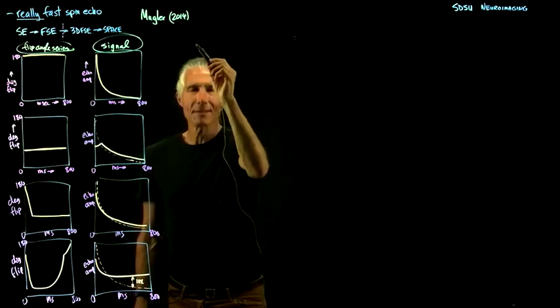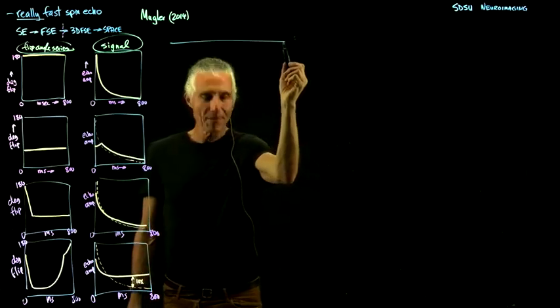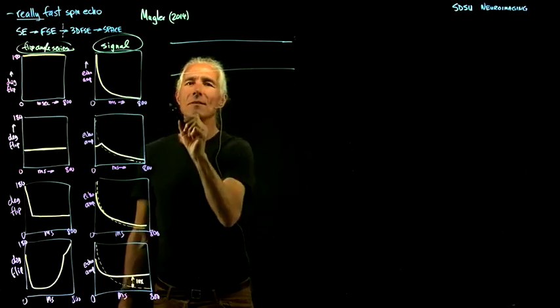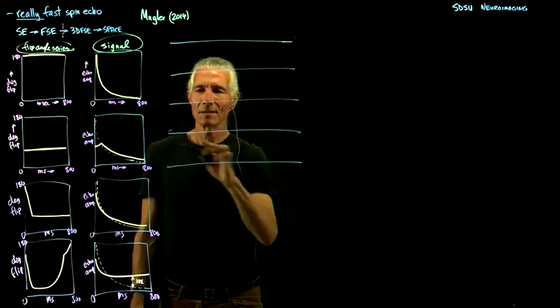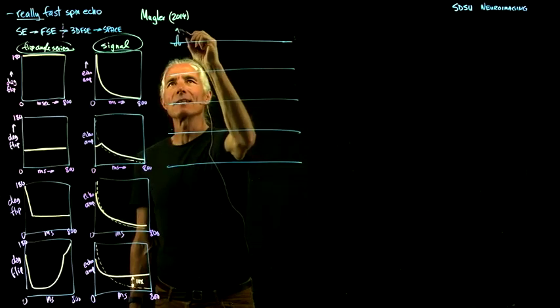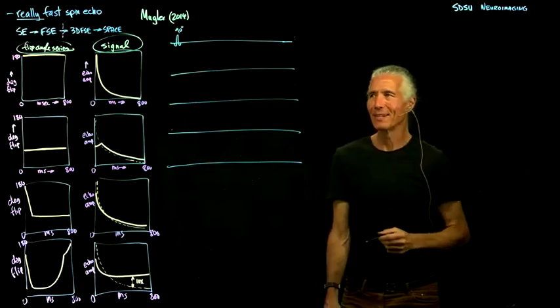So it's sort of deceptively simple, so it's not much to it. So we start off with just one 90. So there's a single 90 at the beginning. And then we're going to make 200 echoes out of it.